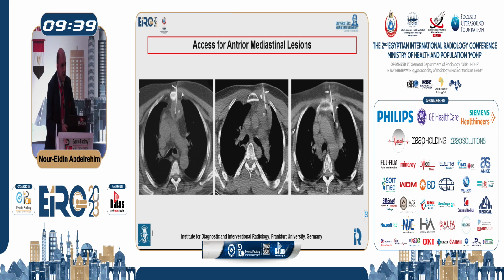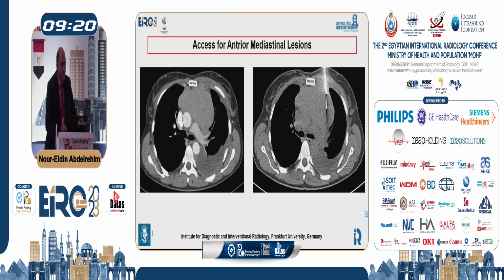The most important point is to take care of the internal mammary artery, because it lies around 1 centimeter from the lateral edge of the sternum. If you cross or transfix the internal mammary artery, you will get massive bleeding. I will show you a case of that. This is a case of a large lymphoma, an anterior mediastinal mass. They also need the hemato-oncologist to differentiate which type of lymphoma it is, through the histopathology, in order to provide the proper chemotherapy.